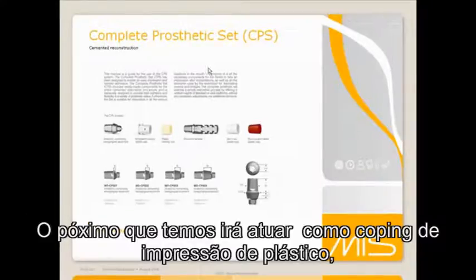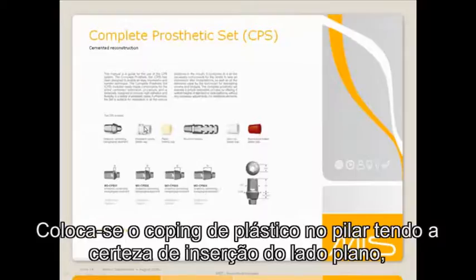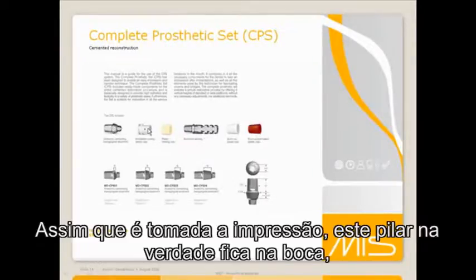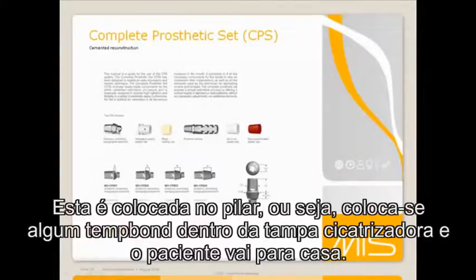The next thing that we have is the plastic impression coping, which has a flat side. There's a flat side on this abutment as well, which you want to place buccal. You are then going to take that plastic cap, place it on this abutment, make sure the flat sides match up, make sure the margins are even at the bottom, and take your impression. Once you've taken your impression, this abutment will stay in the mouth, and you will take what's called the plastic healing cap, which also has a flat side. You'll put a cotton pellet inside the abutment, put some Tempond inside that plastic healing cap, match up the flat sides, and put that plastic healing cap right on the abutment and send the patient home.